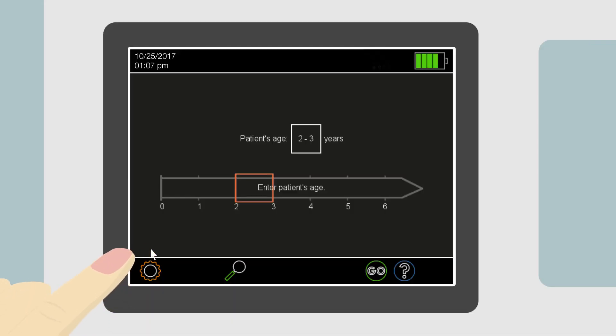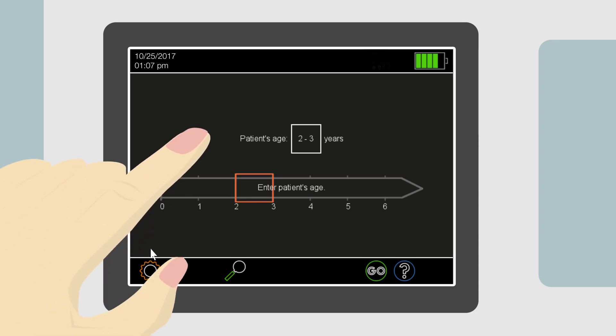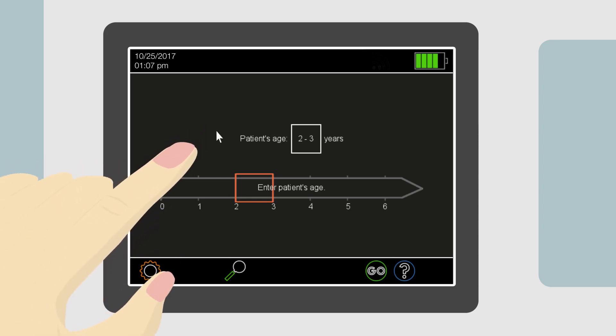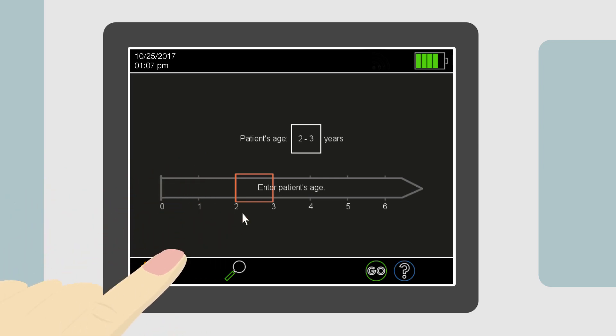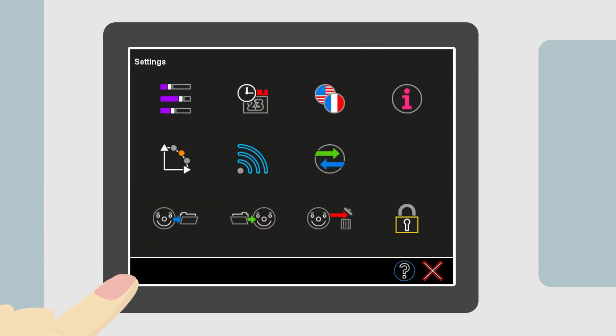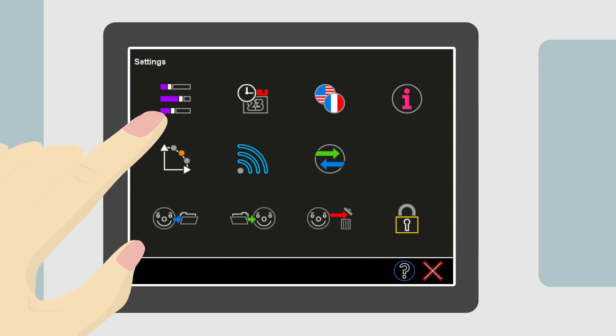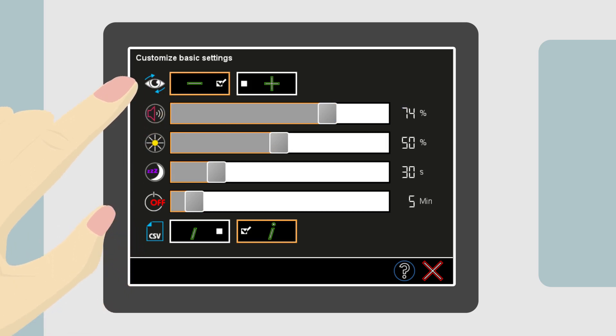Simply touching a button will activate the selection. If the device does not respond to the touch, the touch may have missed the button — the cursor arrow will show where the device sensed the touch. Now touch the Settings button, and then the button for the basic settings on the top left.